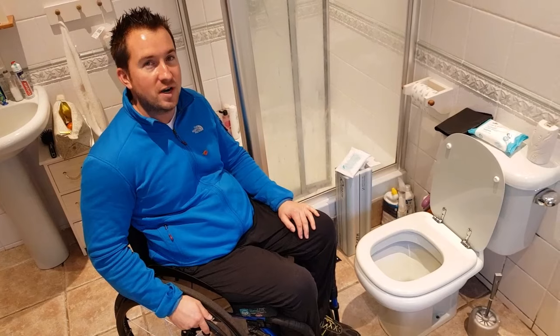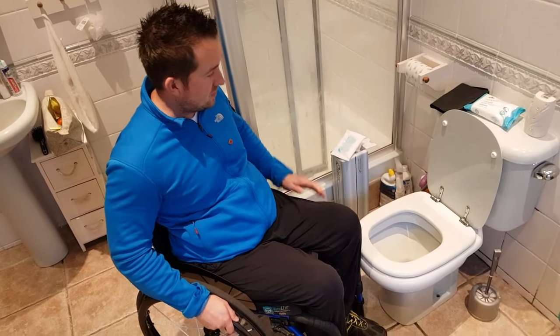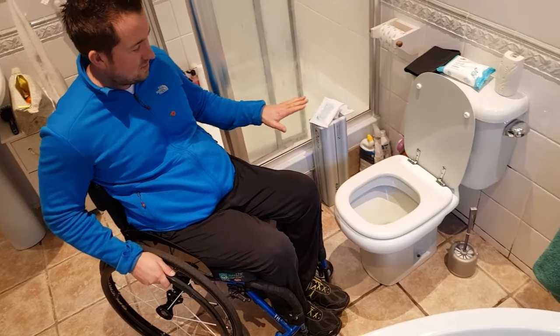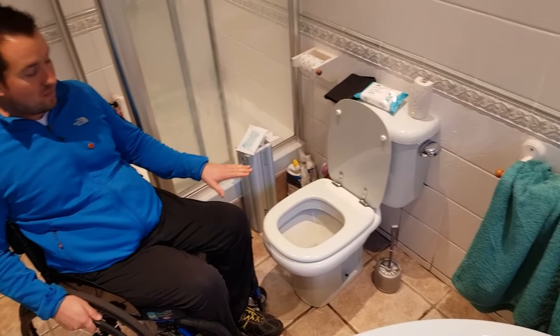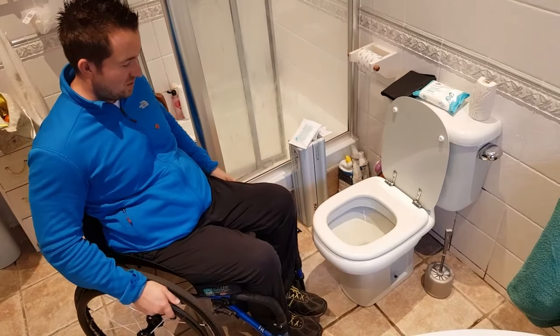I can use the bath edge, which I do regularly, to hold on. Just thought I'd show you how I use a normal toilet — there's nothing adapted here. It is literally quite a wobbly toilet seat and the toilet itself rocks slightly, so it's a really fine example for you.